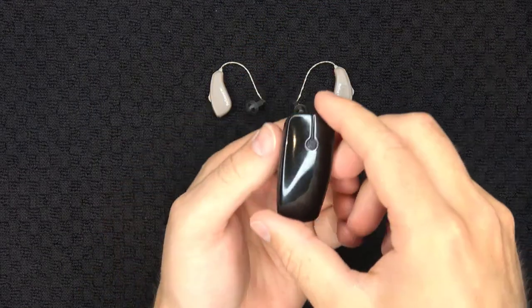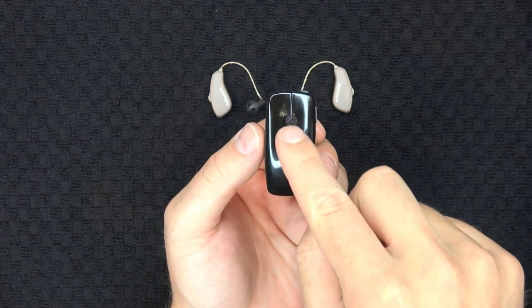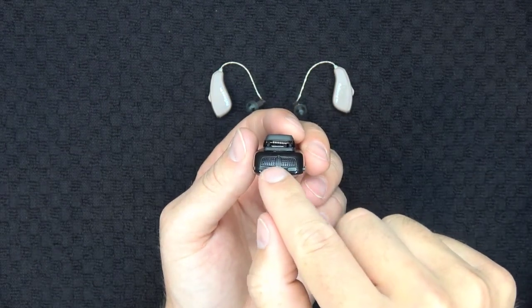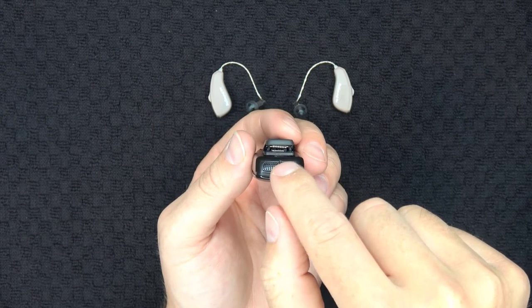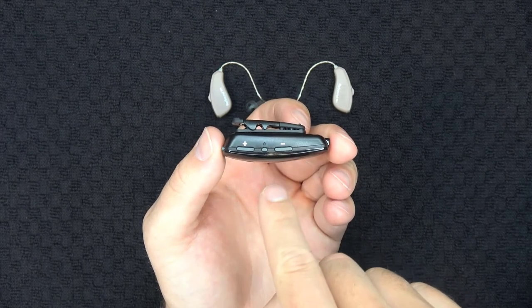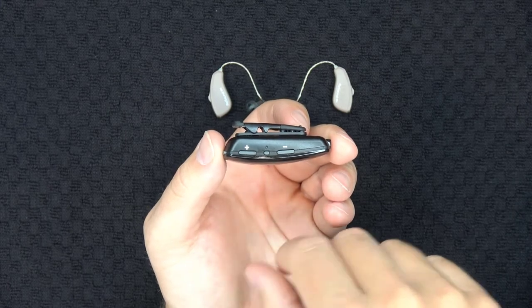Here's the Micromic and here are a couple of its key components. When looking straight down, this small circular opening is one of the Micromic's microphone ports. If you pick up the Micromic and tilt it forward, you'll see another microphone port as well as the power button and a status light. On the side of the Micromic, there are three buttons. The two larger buttons are the plus and minus volume buttons, and the smaller button between them is the mute button.